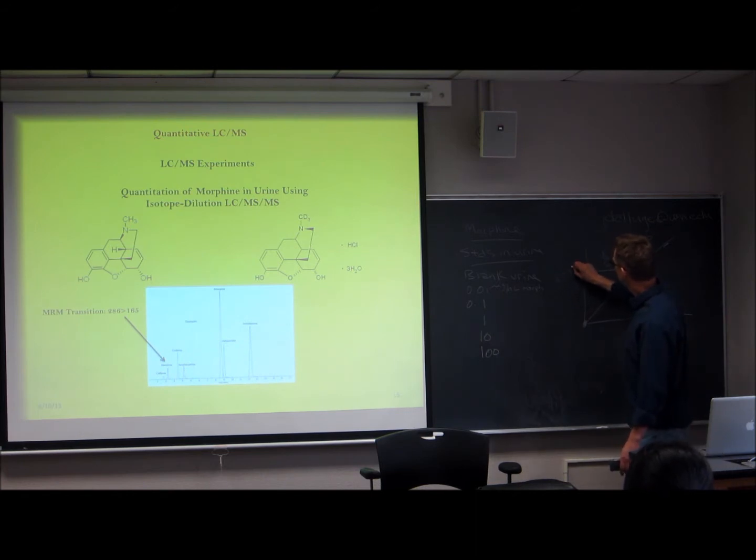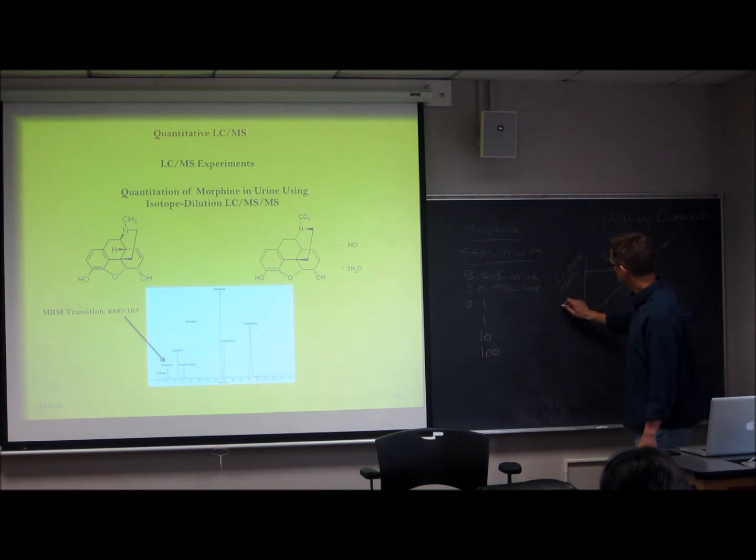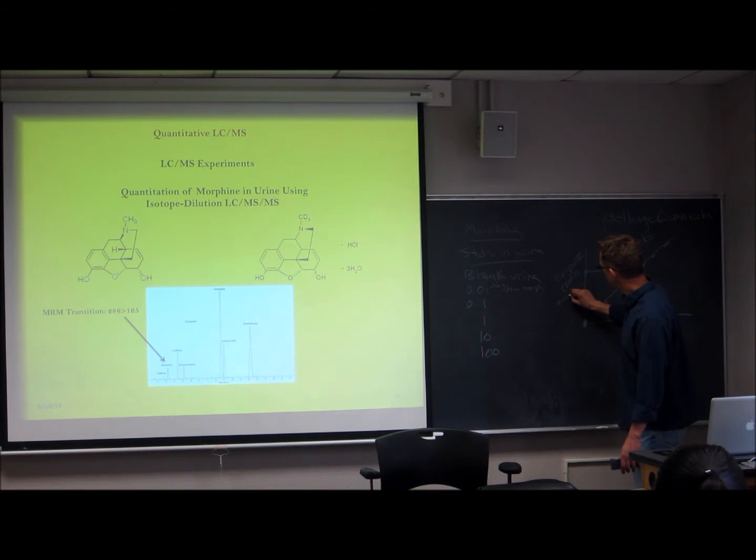So our y-axis in our standard curve is going to become a response ratio rather than a concentration. And this is going to be morphine over D3 morphine.